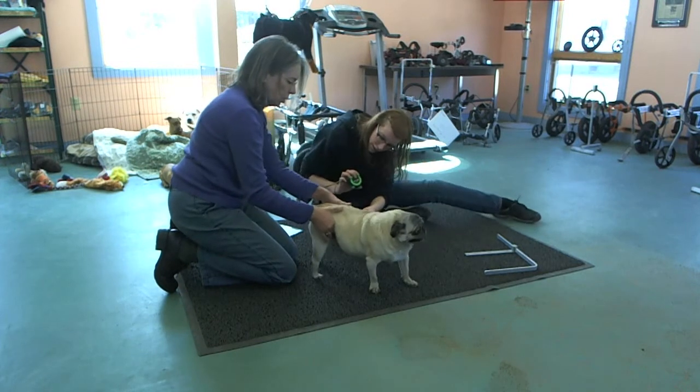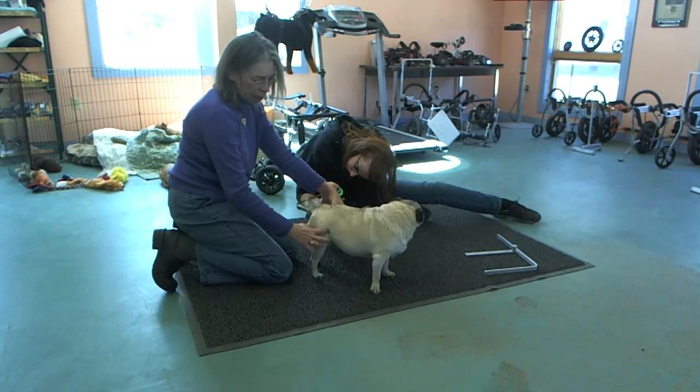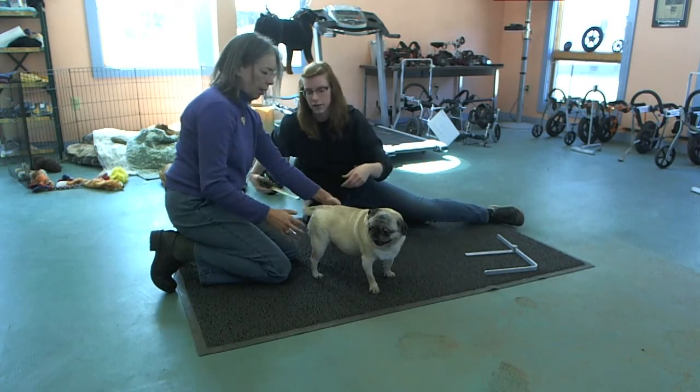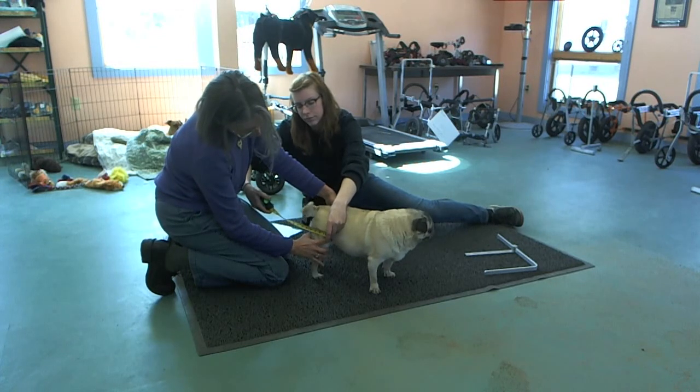Now for C, which is a critical measurement, you want to measure the top of the thigh front to back, from here to here. Four on one side and on this side we have four again.